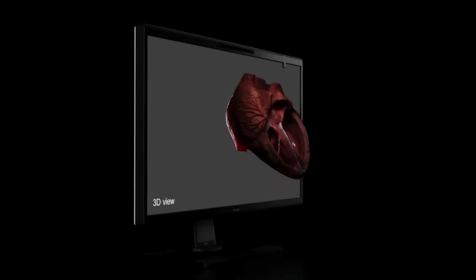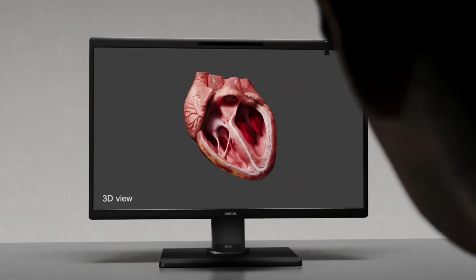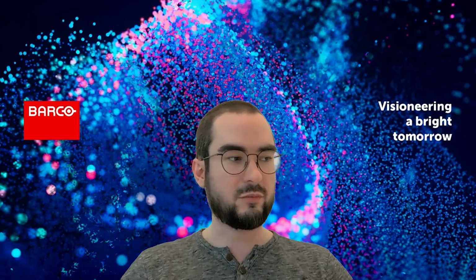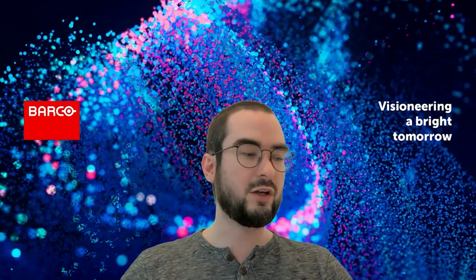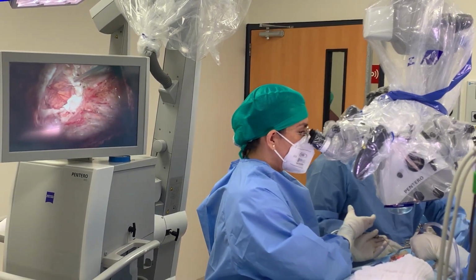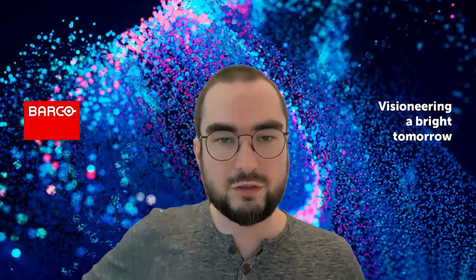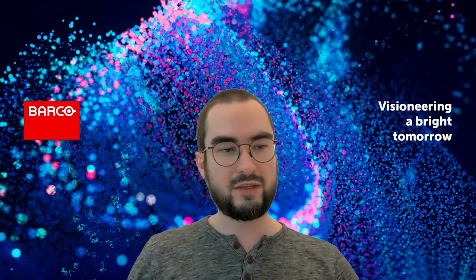And that means that there is a good chance that in a few years, let's not say how many, every display that will be used in a medical environment will have this kind of technology on board, because that really is the ambition. I've talked a lot about the CTs and the MRIs so far, but that's not the only 3D content out there. You also have the 3D that's coming out of endoscopes and out of robotic surgery that can also help during operations, for example. It's a much more challenging use case from a technology perspective, but once the technology has been proven to be usable, you can scale to these kinds of use cases as well, and that's very valuable.